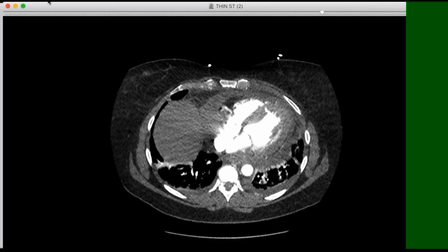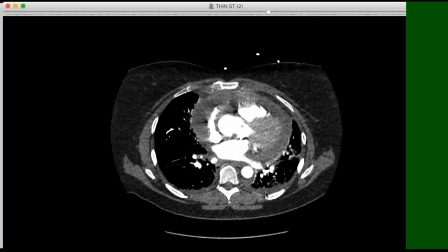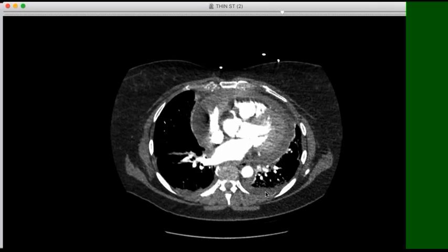Jeff, the people around here have made the point that when you have pericardial inflammation, you often get an accompanying left pleural effusion. Why is that? And it's a helpful finding, because if you see what looks like a large heart, but instead of having a predominant right pleural effusion, it's predominant left, it pushes you away from heart failure, because in heart failure, it's almost always larger on the right than the left, but does point you in the direction of pericardial inflammation. I've seen that be very helpful in a number of cases.